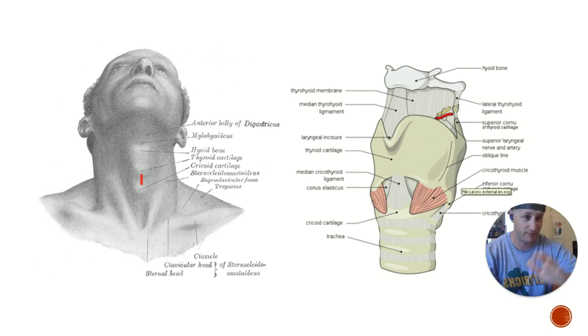Tape this up, secure this up, suture it down, use the strap that it comes with. Whatever you have to do to secure it down. But that's how you do a cric. It's going to bleed. It's a tactile procedure. Feel it with your fingers. It's going to bleed a lot. If it's not bleeding a lot, they're probably way dead and you waited way too long to do it. So it's going to bleed. Just know that.